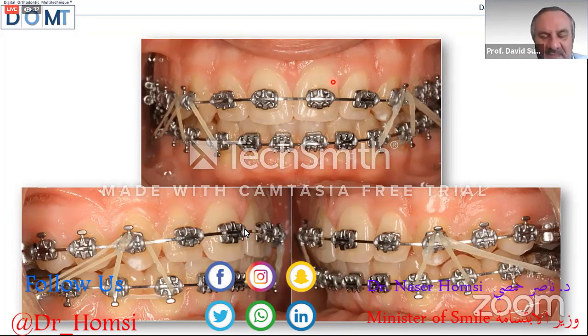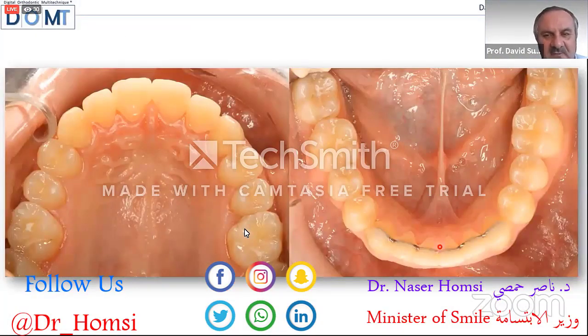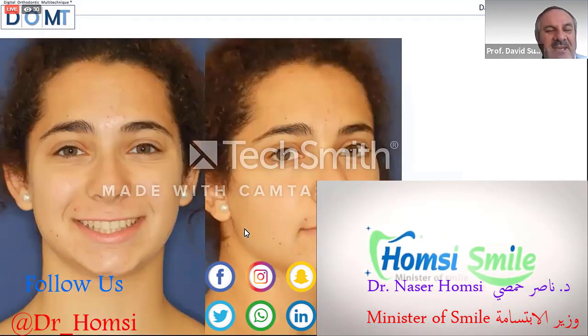The big advantage of the Synergy bracket is the possibility to control the friction and the orthodontic tooth movement tooth by tooth. For example, in this case, we need maximum control of the canine, the upper right canine, and I ligate the Synergy bracket in a figure of 8. This is conventional, and if you need low friction in the Synergy, ligate the Synergy only in the central wings. Okay, you can see the result, a very fast treatment, a very nice result, a very nice smile.